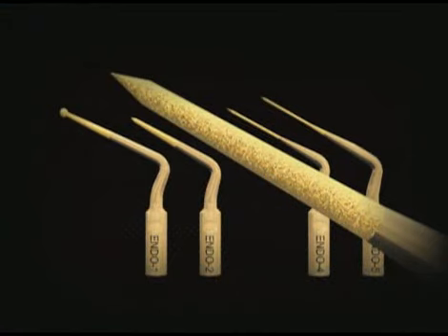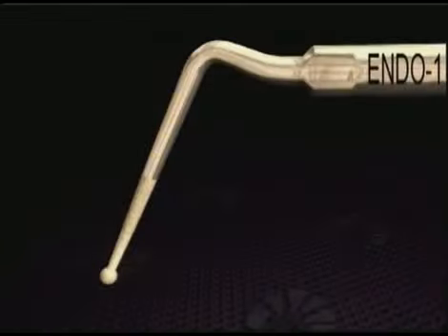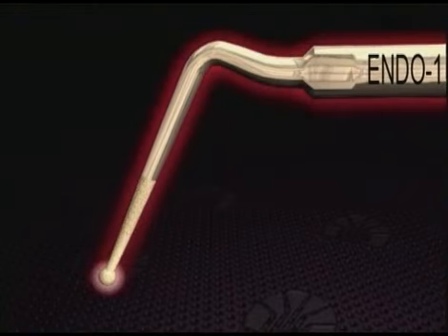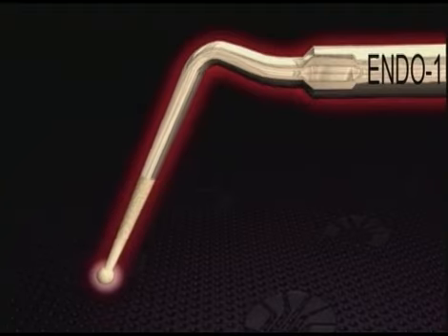The zirconium nitride coating enhances durability and enables the instruments to sand away materials during endodontic treatment and disassembly procedures. Because of its superb energy transfer, the Endo 1 will frequently dislodge most posts. This ultrasonic instrument has a ball at its working end, which, when kept in intimate contact with a post, maximizes energy transfer and promotes cement bond failure.